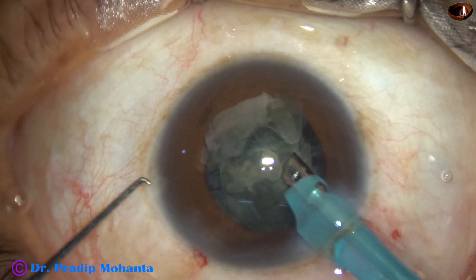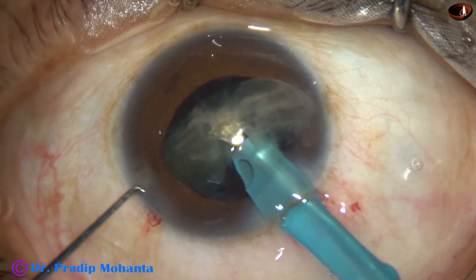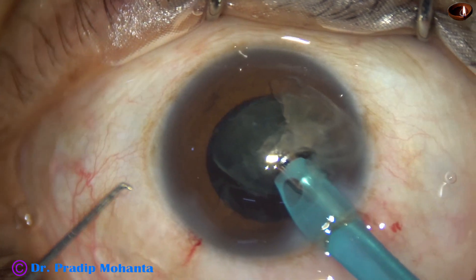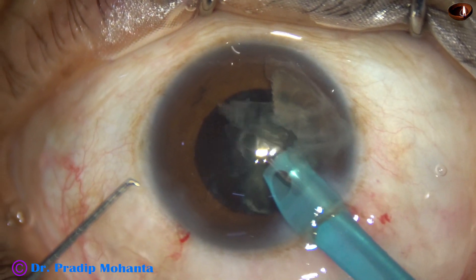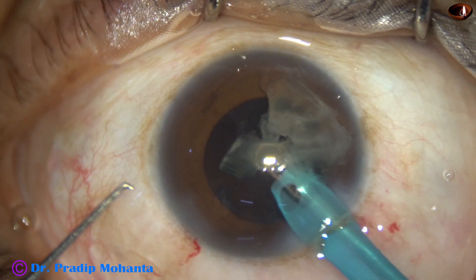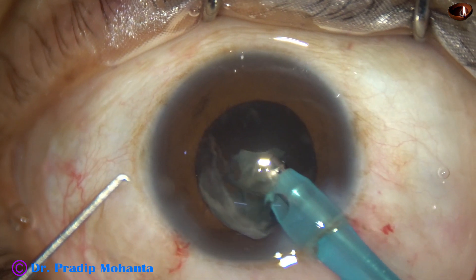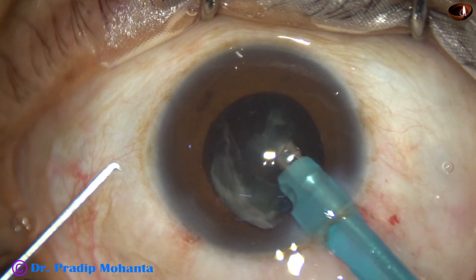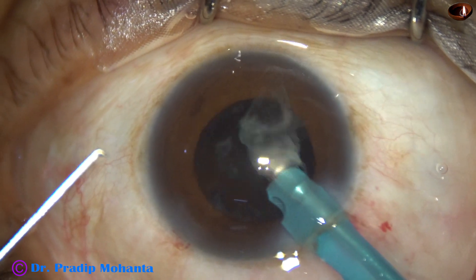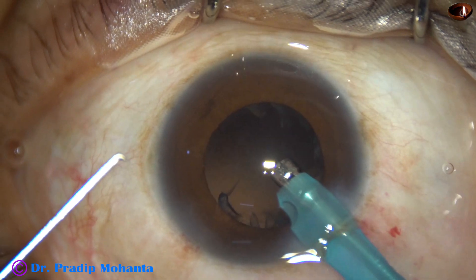She is diabetic for several years and that's why the lens fibers are sticky — they don't tend to get separated. This is the last portion of the nucleus; at this time the vacuum is decreased, flow rate is decreased, and with a great safety margin the nucleus is managed.